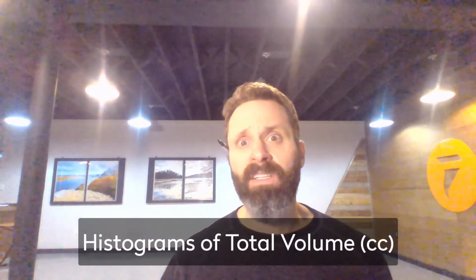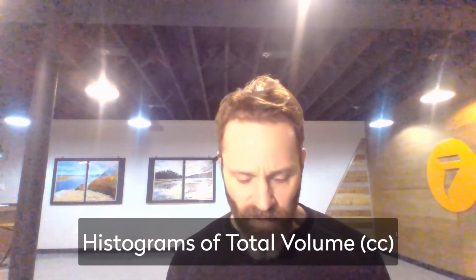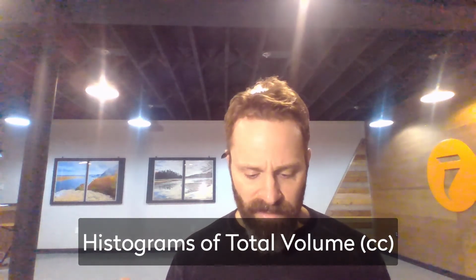First, we're going to go structure by structure, and we're going to look at a very coarse look at variation. We're just going to look at histograms of the volume. So different people's opinions of how big the structure was. So we'll look at volume histograms first.